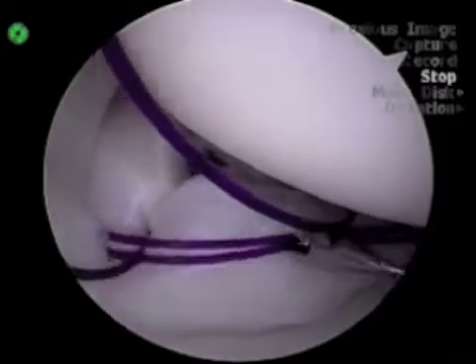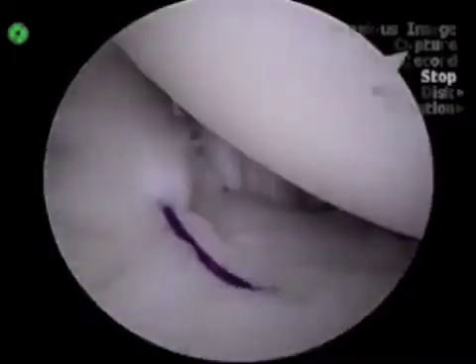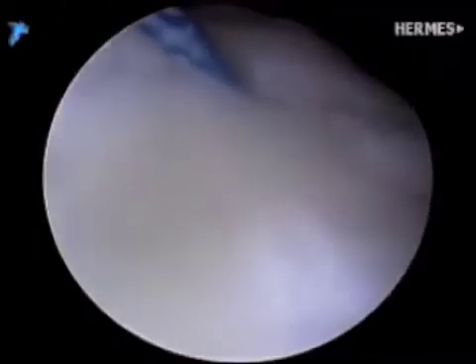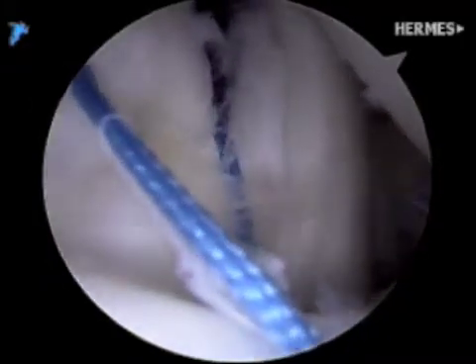A rotator cuff interval closure is recommended. The coracohumeral ligament, as part of the leading edge of the supraspinatus, should be captured with the closure. Using the PDS suture, a permanent suture can be shuttled through the rotator interval and the interval shortened, providing additional stability.